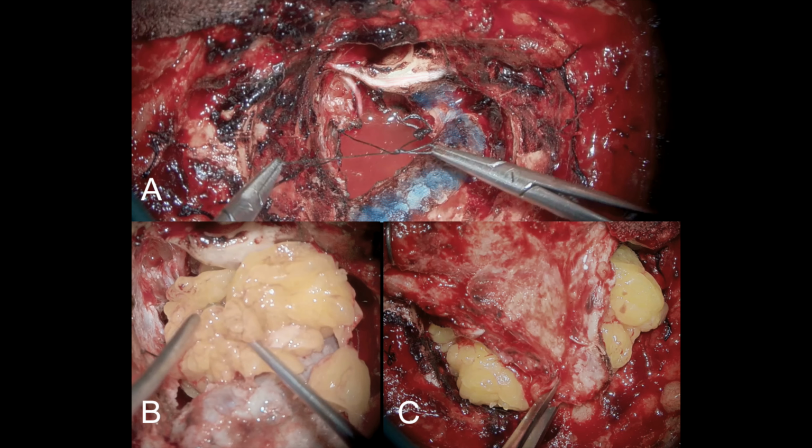Once the tumor is out, the H flaps are closed with a single supporting suture across their midpoint. A watertight seal cannot be achieved, but this suture prevents the fat graft from herniating into the posterior fossa. The fat is positioned so that anterior and posterior lobes gently cork the opening, supported by the suture bridge. A vascularized pericranial flap is rotated over the fat, and the wound is closed in multiple layers to achieve the best possible seal. Now let's review a case example.